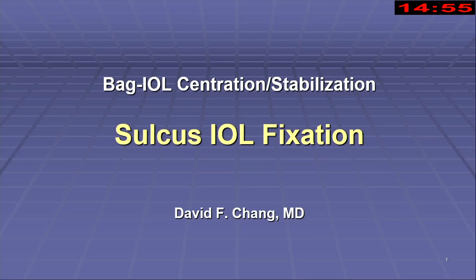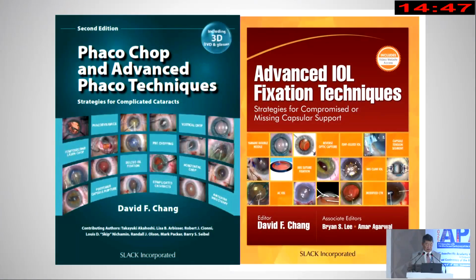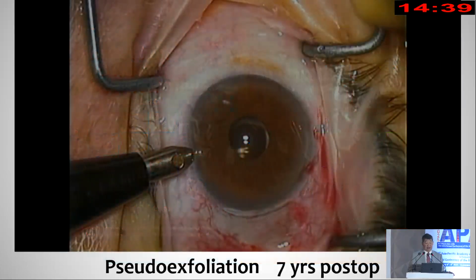So I'm going to talk about a different situation where you don't necessarily know you're going to be in trouble, because you just think you're doing a cataract surgery with pseudoexfoliation. I have no financial interest in this talk. These are some of my textbooks that cover a lot of this, and some of the videos are there.